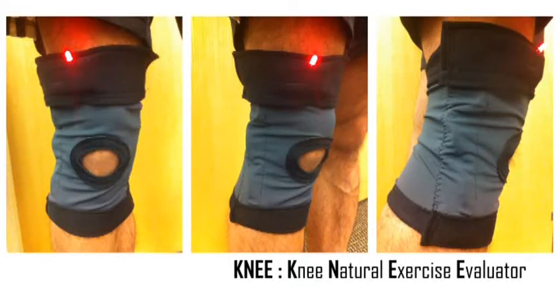Presenting the Knee, the Knee Natural Exercise Evaluator, an everyday wearable goniometer.